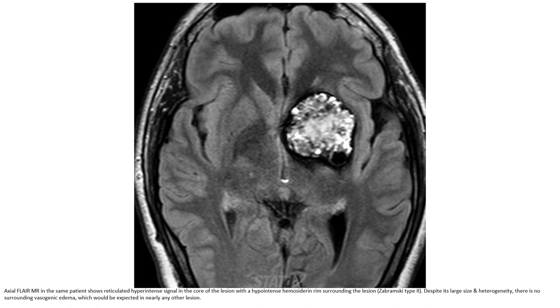FLAIR and T2 MRI in the same patient show reticulated hyperintense signal in the core of the lesion with a hypointense hemosiderin rim surrounding the lesion. Despite its large size and signal heterogeneity, there is no surrounding vasogenic edema, which would be expected in nearly any other lesion.